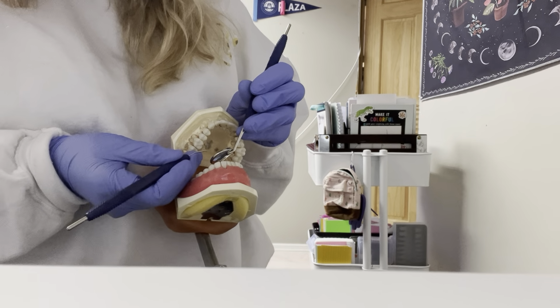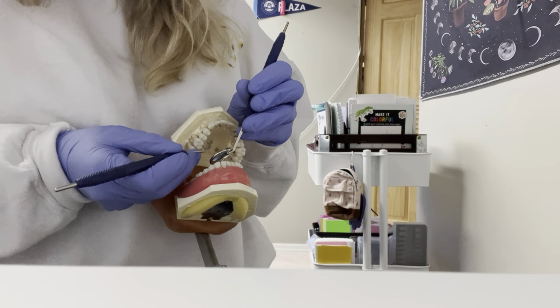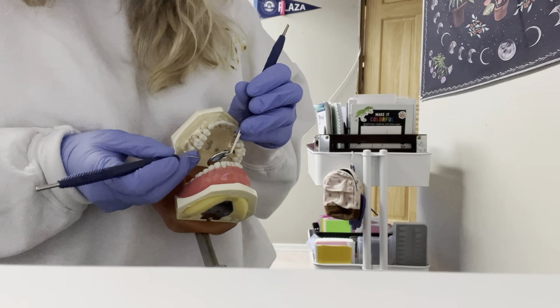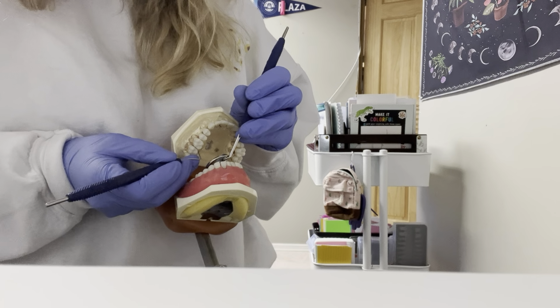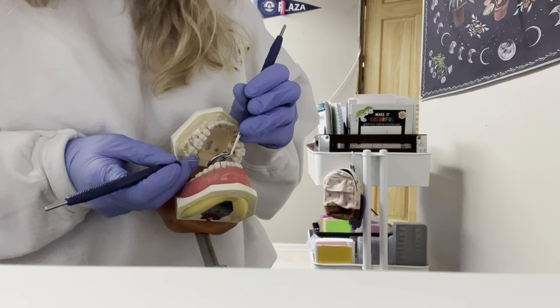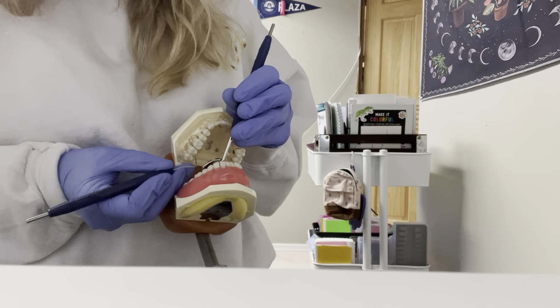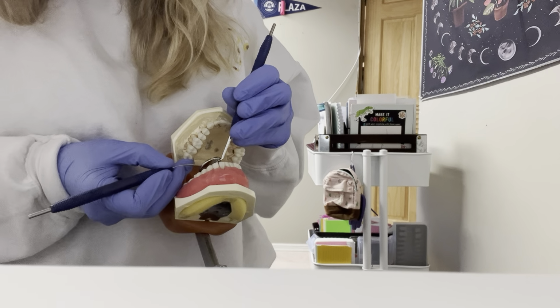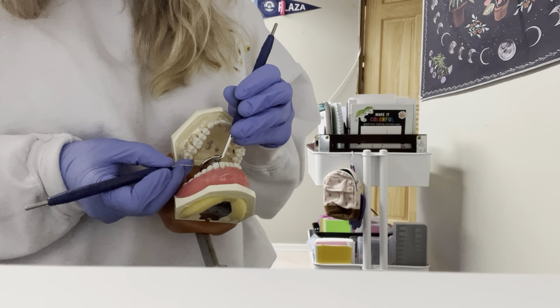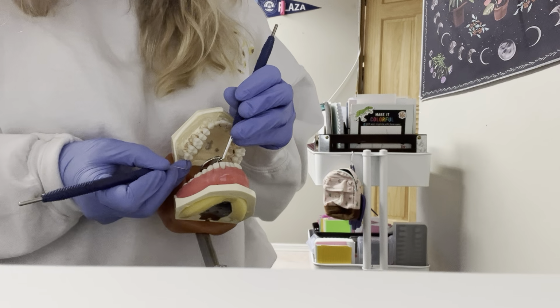When probing, you're going to find out where is most comfortable for you, and you don't always have to sit at the same clock position the entire time. I find it most comfortable to sit at a 12 o'clock position for most of my time while I'm probing. I feel like it's the easiest way I can get the probe into the sulcus on that angle.